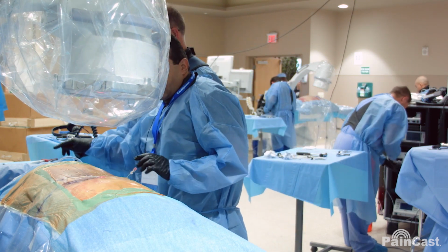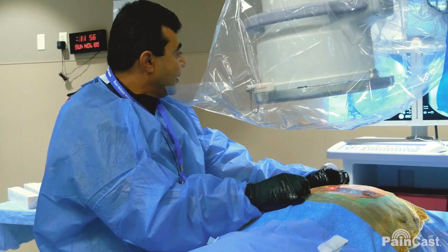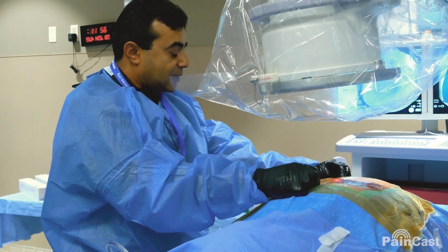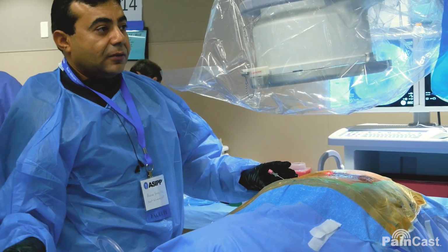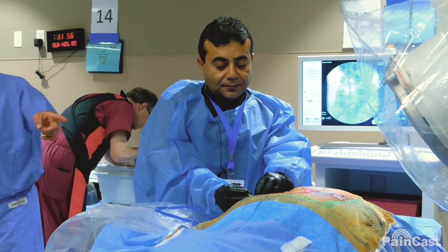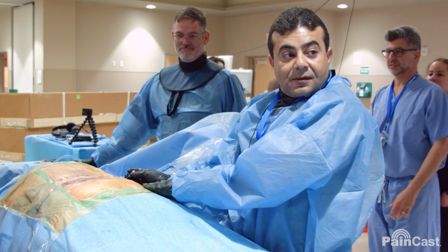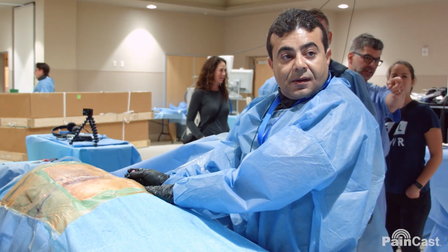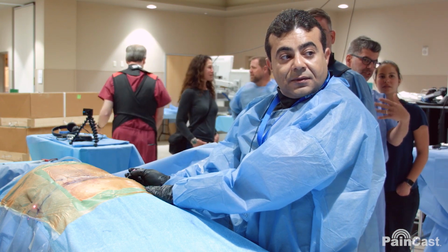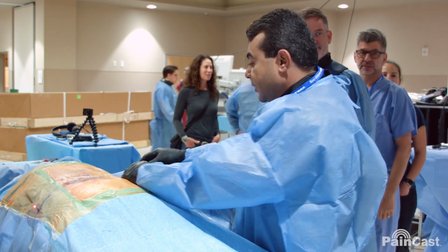For people, just to confirm again, what is the medial pedicular line? That is the line where the medial part of the pedicle is. Okay, so we're here, we didn't cross it. Now we go lateral to confirm, yes, we are touching the disc. We're exactly going through the disc. X-ray. We are in the disc.